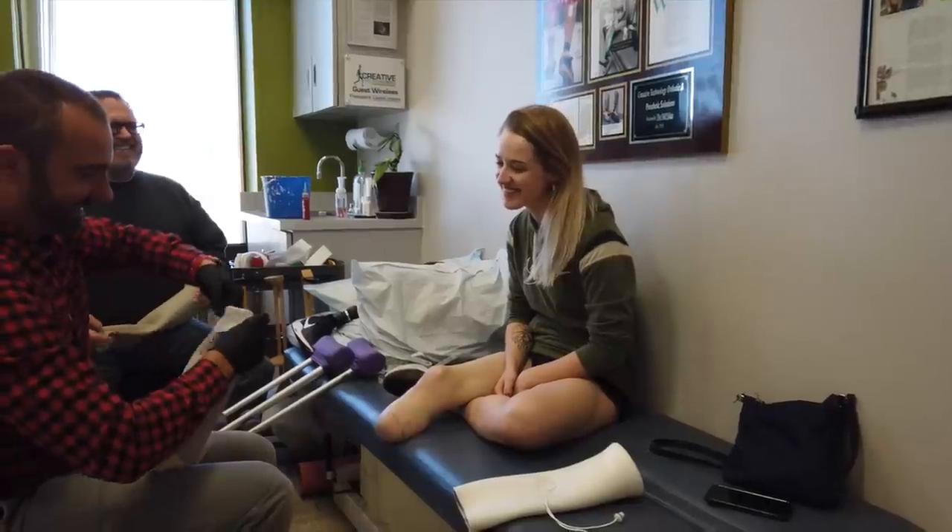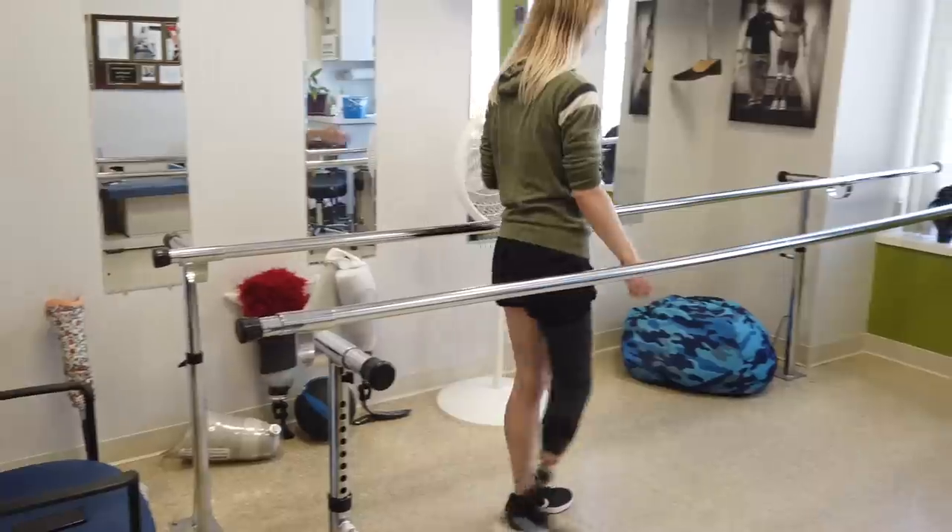Good morning! Welcome to day one of life with a prosthetic leg that might actually work. Last night I went out with a couple friends and my husband to celebrate my one-year amputation anniversary, which very poetically was also the day that I got fitted with and got to bring home my new prosthetic leg.